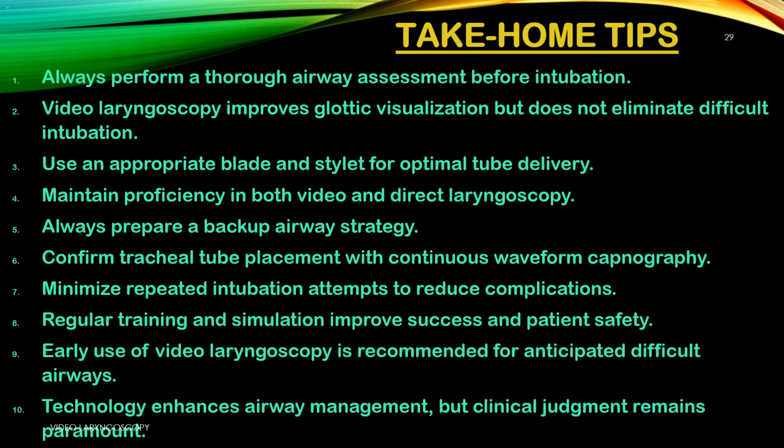5. Always prepare a backup airway strategy. Have a supraglottic airway or surgical kit ready before you start. Plan B saves lives. 6. Confirm tracheal tube placement with continuous waveform capnography. CO2 waveform is the gold standard to prove the tube is in the trachea, not the esophagus.